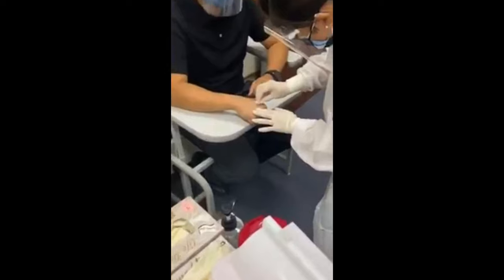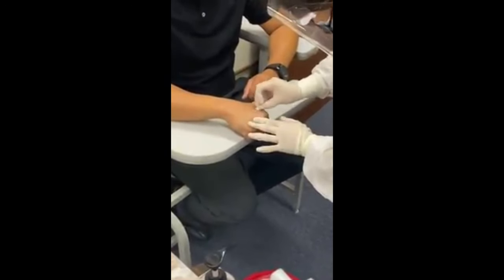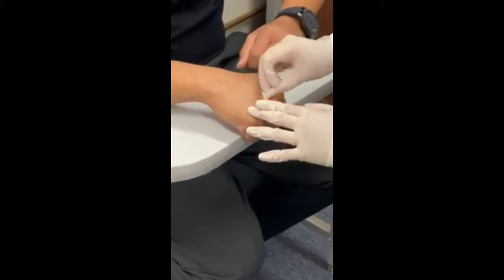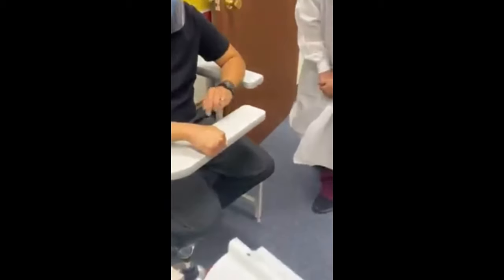Okay, so that's good that you're feeling before you sanitize, so that's perfect in there. It gives you an idea where you could touch the vein one more time before you sanitize it. And then if you do want to feel again, it would have to be either below or above the site, but not where you're going to stick. Okay, so that's perfect. So while it's drying, what can you do?